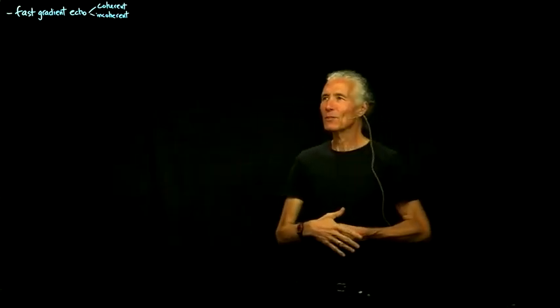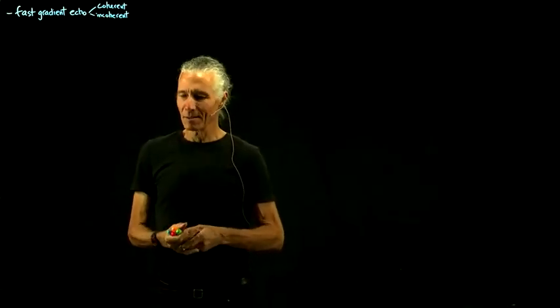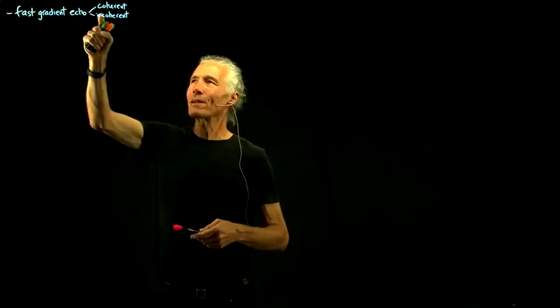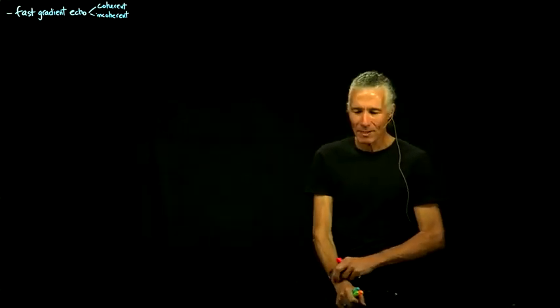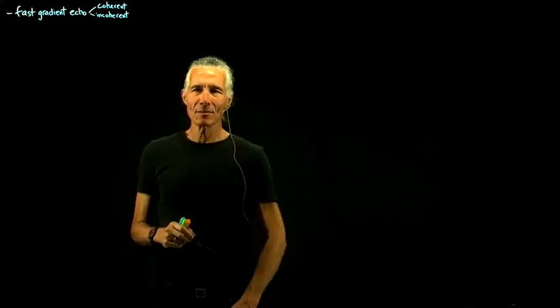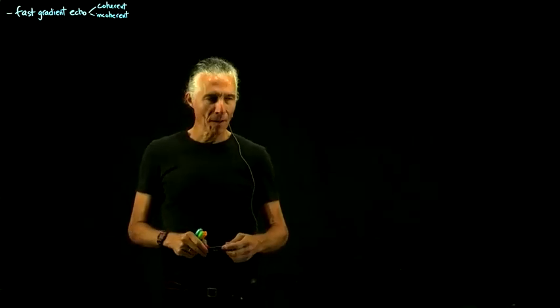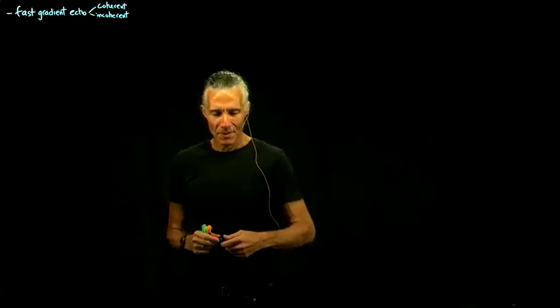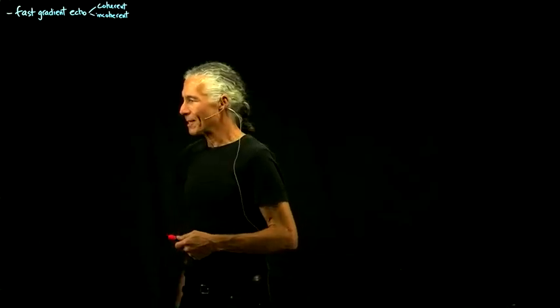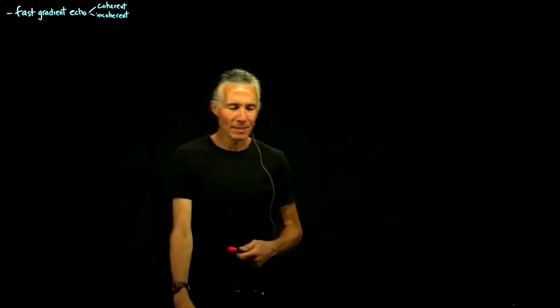gradient echo, and there's two different kinds of it. There's coherent and incoherent, and the coherent ones are probably less familiar because they're not actually used that often. The problem with these things is always they have all these ridiculous acronyms.